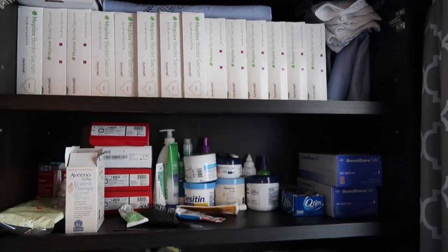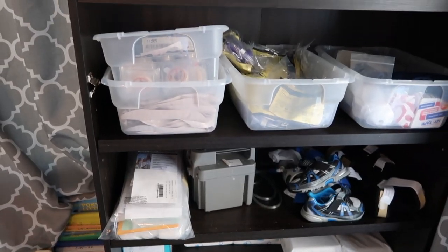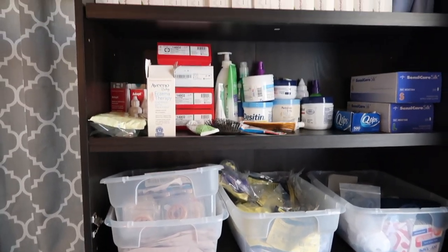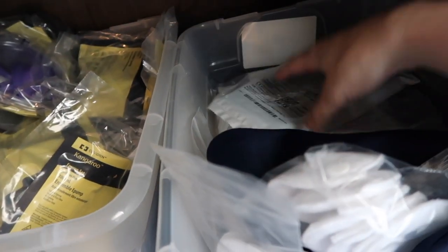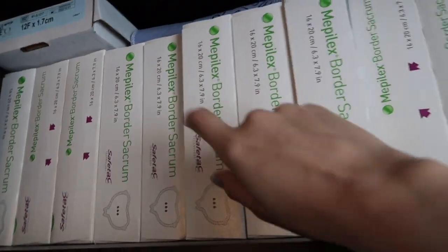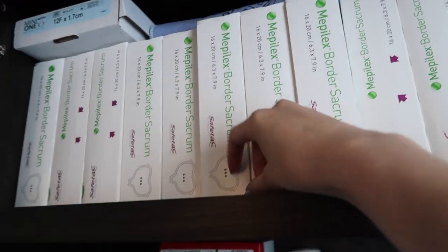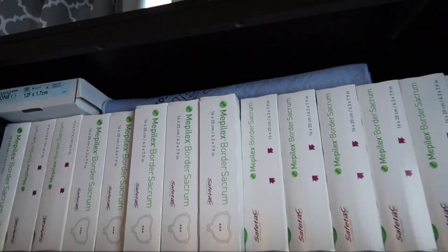So this is where we keep all of Keegan's supplies. It's mostly ostomy bags and ostomy supplies, and G-tube supplies and G-tube covers and connectors. And up here we just have sacrum pads, which if you're not sure what a sacrum pad is, it's just padding that goes on your butt to prevent any pressure sores.